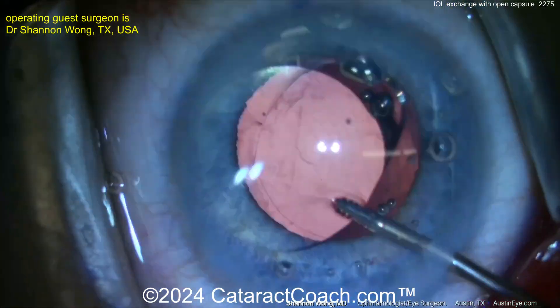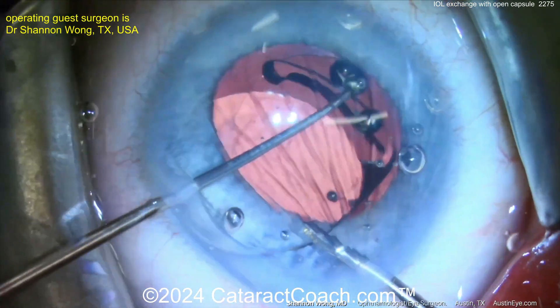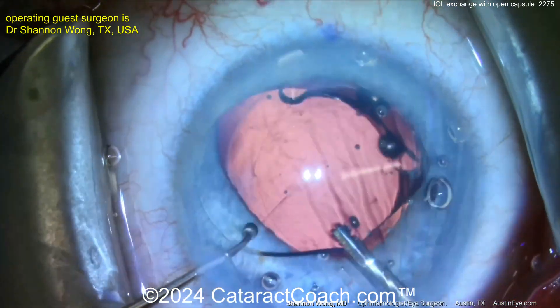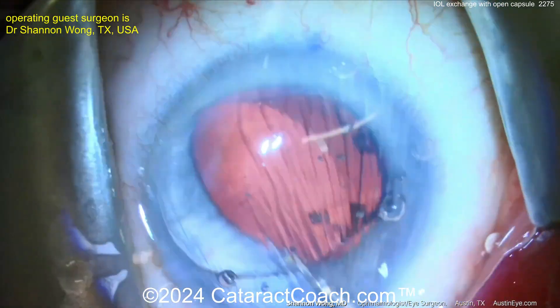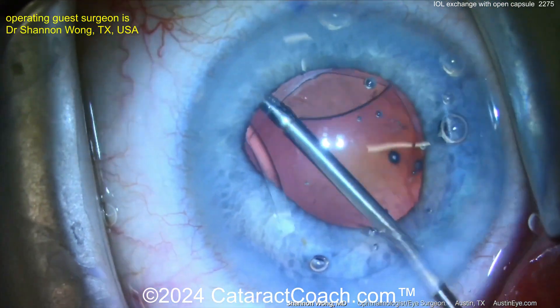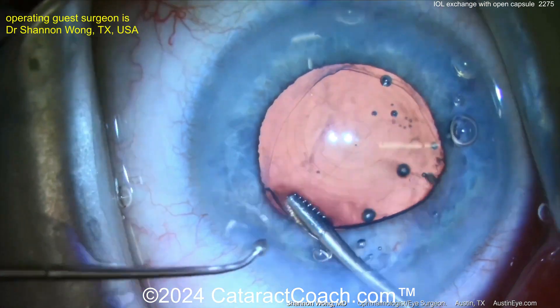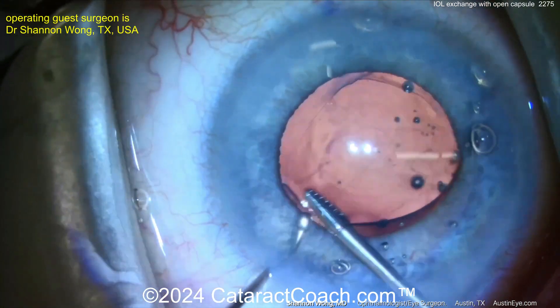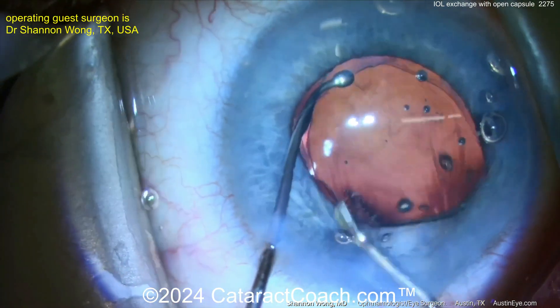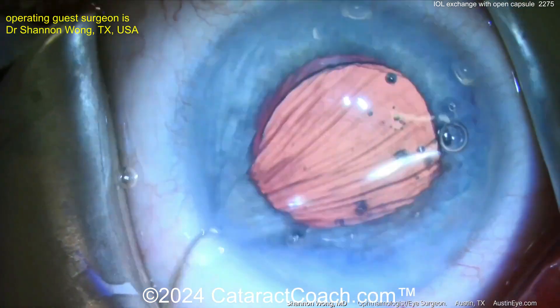You need to place the new lens in the bag — don't think you can place this in the sulcus. Dr. Wong is holding the optic and dialing in one haptic at a time, using micro forceps to hold the optic and get the lens positioned, then getting the other haptic in. You need to do this without further opening the posterior capsule, using the anterior and posterior capsular rim that's still there. This IOL is completely in the bag, not in the sulcus.